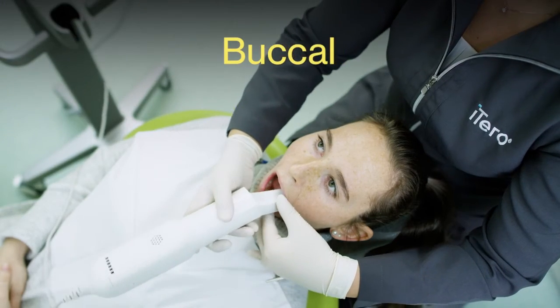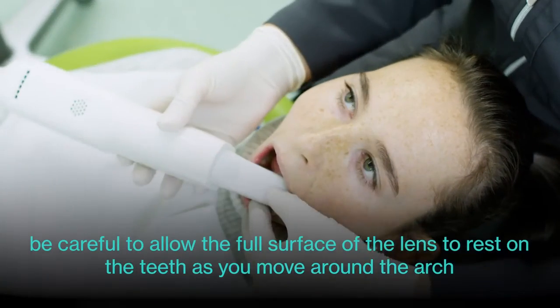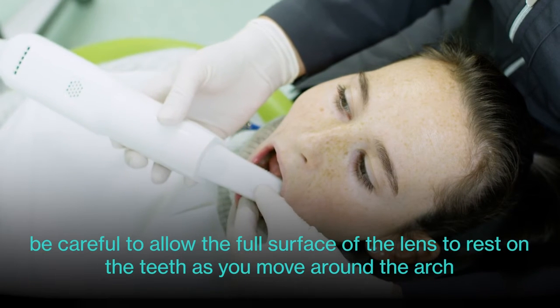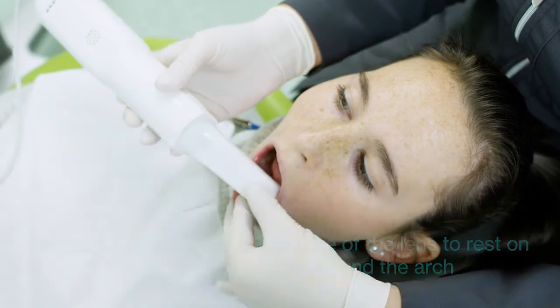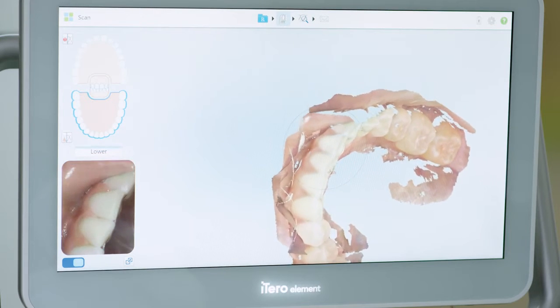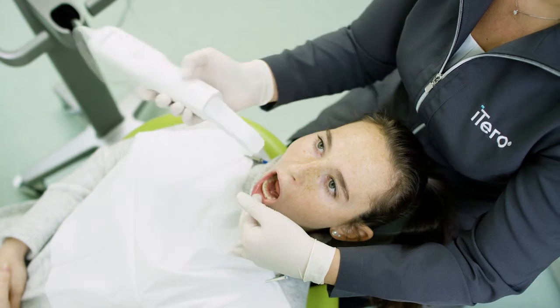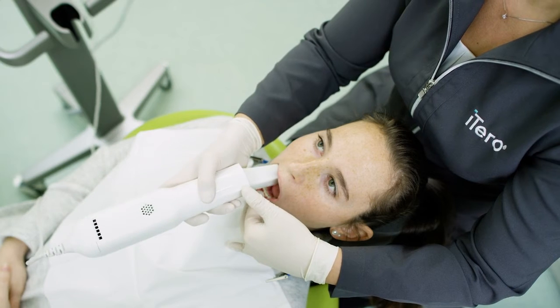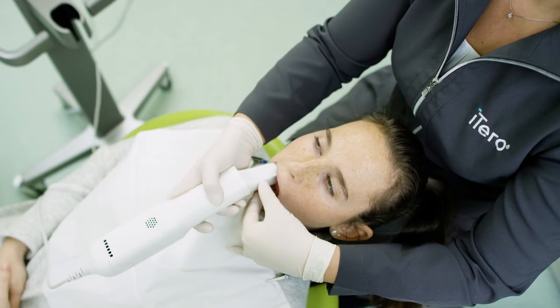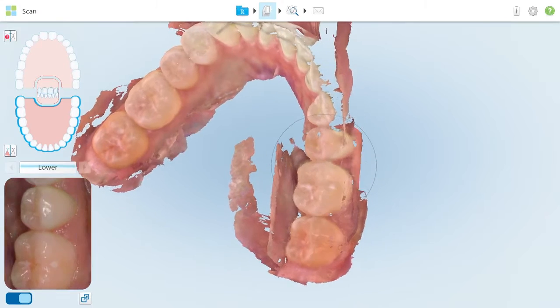After completing the lingual, rotate to the buccal and move towards the anterior, being careful to capture the interproximal anatomy. Moving from posterior to anterior when scanning the buccal surface reduces the interference from the cheek and provides a smoother scanning experience.